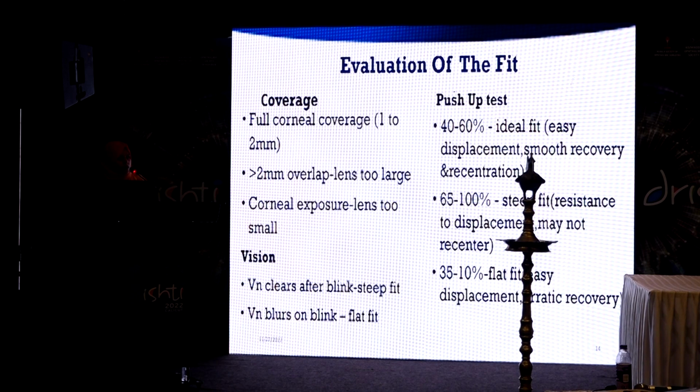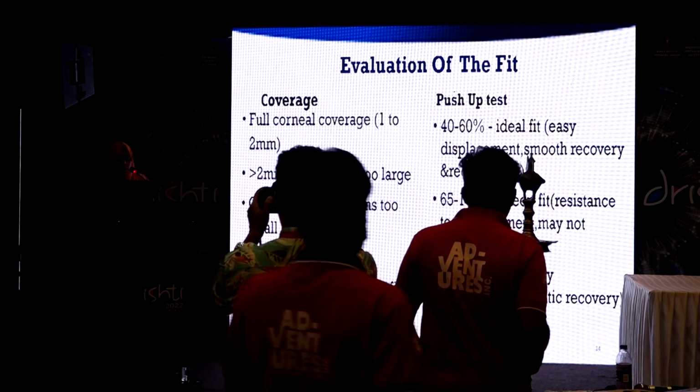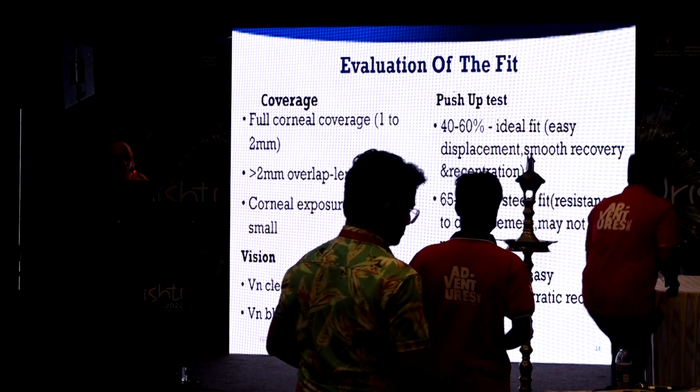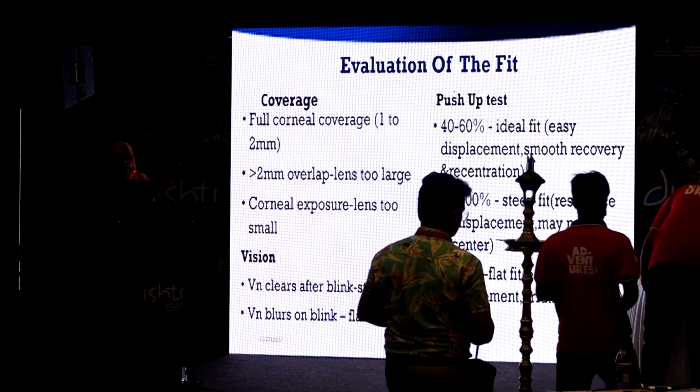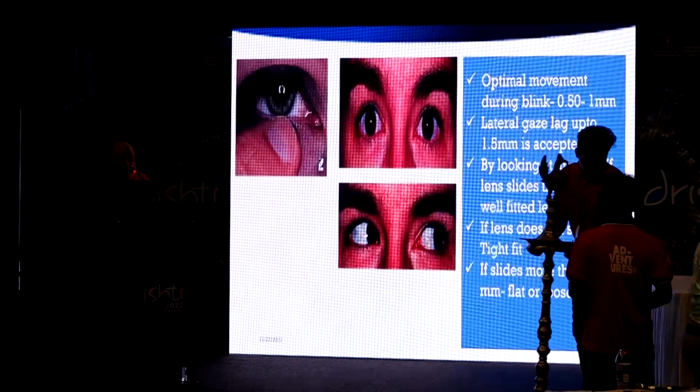And we have to check for the vision. If vision clears after blink, it is a steep fit. If vision blurs on blink, it is a flat fit. And also the push-up test: you have to check, the ideal fit will be 40 to 60%. So there will be an easy displacement, smooth recovery and recentration. And if it is 65 to 100%, it will be a steep fit. And if it is 35 to 10%, it is a flat fit.